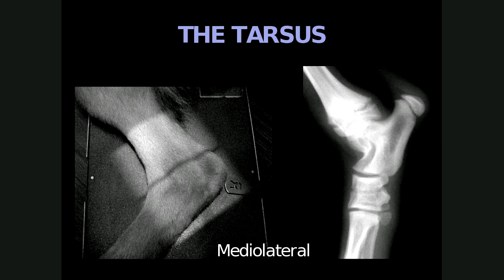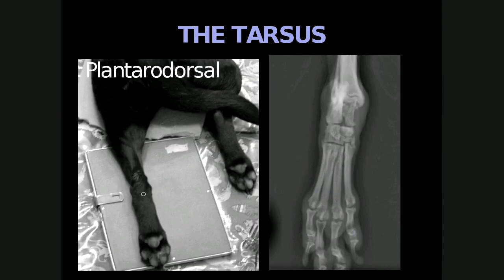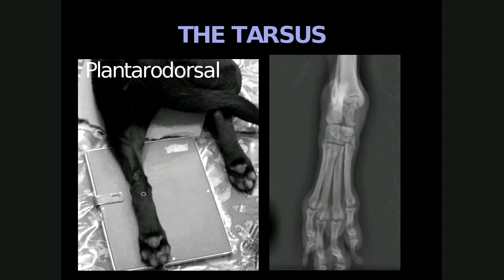When we look at the tarsus, there are two views needed for evaluation: the mediolateral and the plantarodorsal. For the mediolateral, the patient is positioned in lateral recumbency with the affected limb closest to the cassette, the unaffected limb is moved away, and the joint is in a natural flexed position with the beam centered on the middle of the tarsus. For the plantarodorsal view, the patient is in sternal recumbency, the limb is extended caudally alongside the body and slightly abducted from the body wall to prevent superimposition, and the stifle may need to be rotated medially to ensure a true plantarodorsal position, with centering on the middle of the tarsal joint.